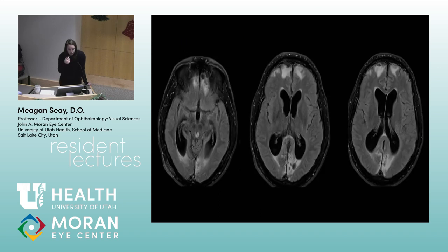So again, to localize people with central islands of vision in both eyes, it could be a retina problem, like retinitis pigmentosa, which causes a lot of peripheral vision loss but spares central. Advanced glaucoma could look like that. Or if it's cerebral, then it's bilateral occipital, sparing the posterior poles. Any questions on that one? Do you still have that good of a foveal threshold if it's really advanced RP? Maybe not.